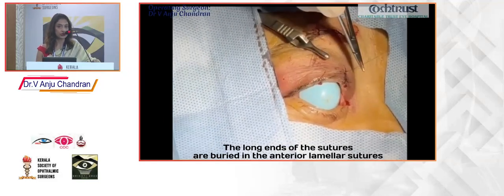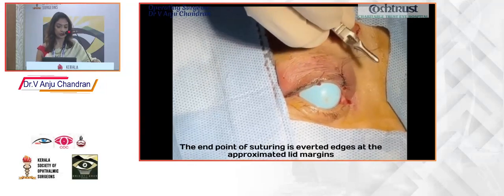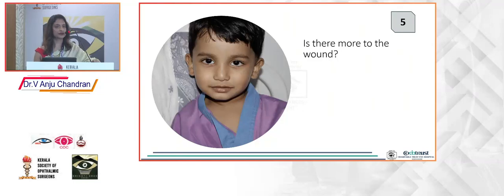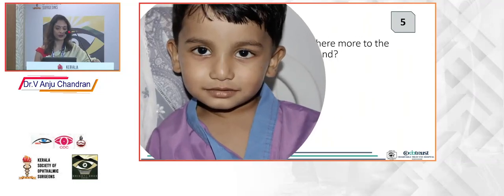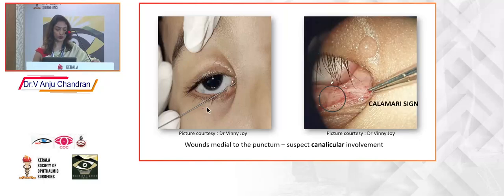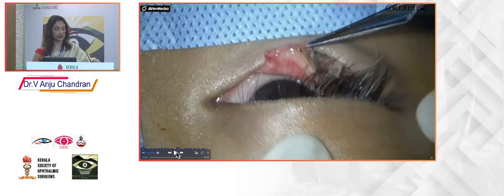The endpoint of suturing is basically you should have everted margins of the lid and not inverted ones, because when it heals, you might have a lid notch. Now look at this very calm-looking child. If you look carefully, you would think that there is no wound, but any wound where you have a medial injury, always look for a canalicular tear.